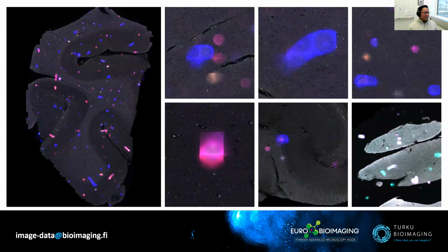Another issue with these slides that we have encountered is in the different fluorescent channels. You can see there in this particular one, it's quite bad. So there are a lot of imaging artifacts. So before we do any automated analysis here, we have to somehow exclude these areas.